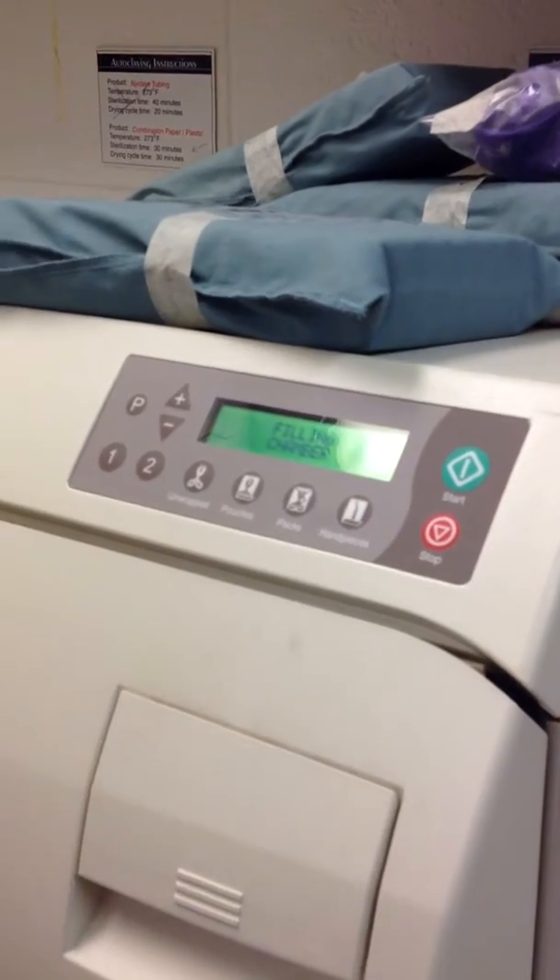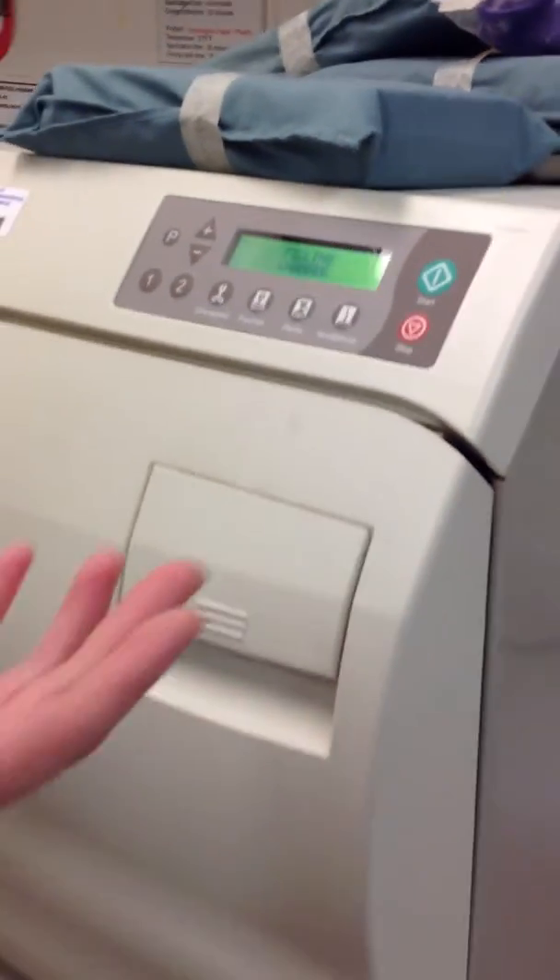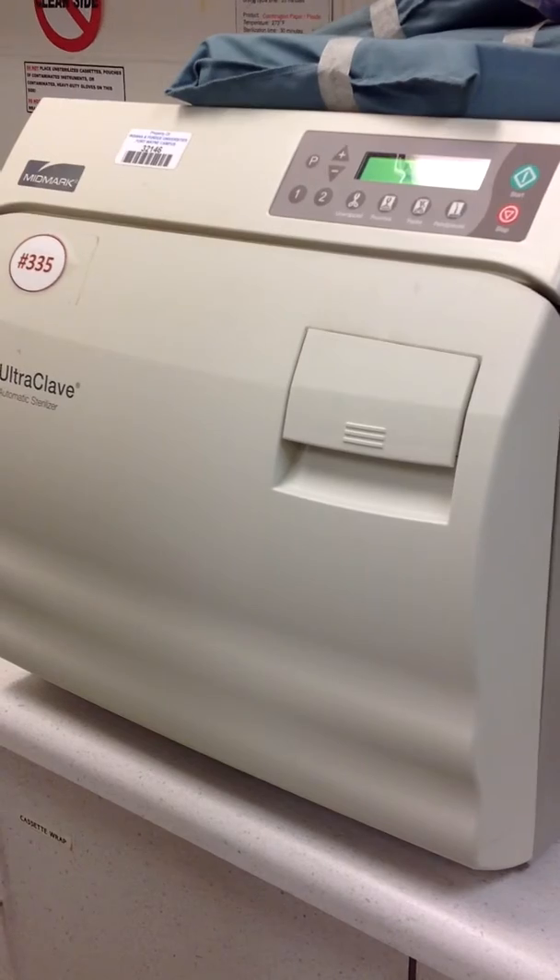When the autoclave is done, the door will pop open, steam will be released, and your cycle is complete.